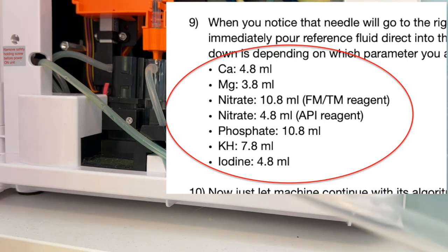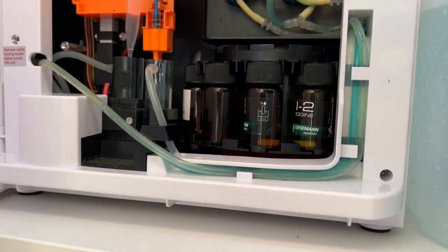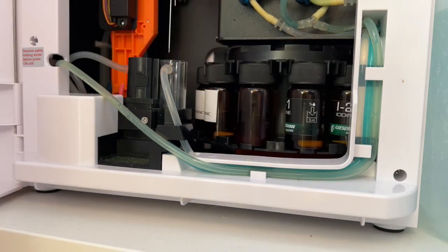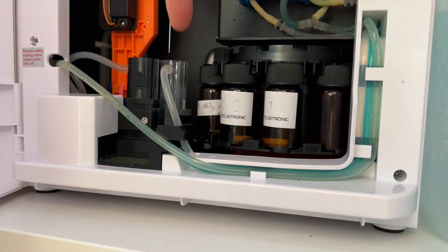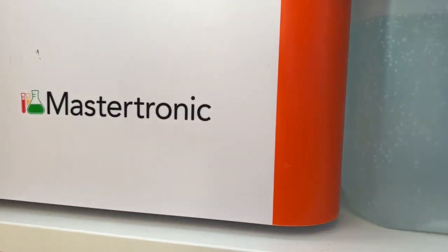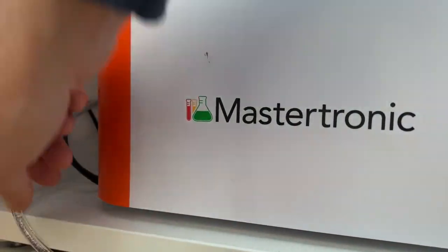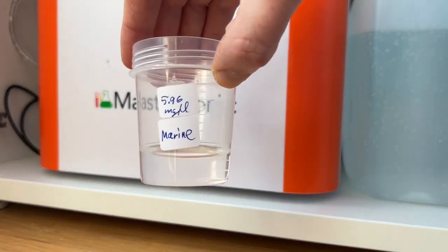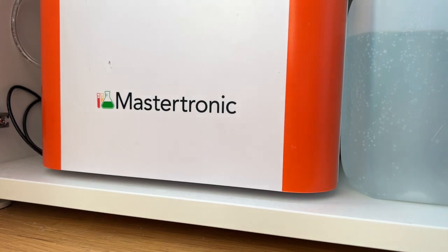Pour the sample volume into the reaction chamber — this is the volume to be measured. Now you are ready and don't have to do anything more. Just observe. The cursor starts and the needle will go to the reagent. At this moment, close the door and put back the sample hose. The machine will do the test for you, and we will soon compare the result to the reference fluid value of 5.96 in this case, to see how close it is.